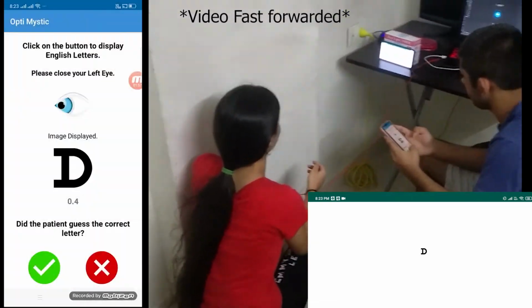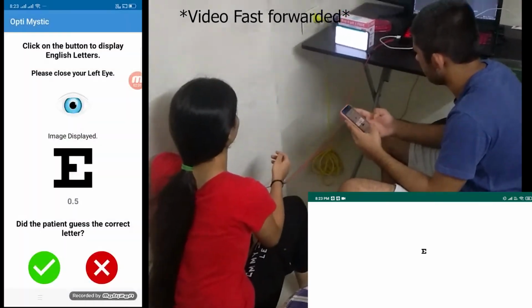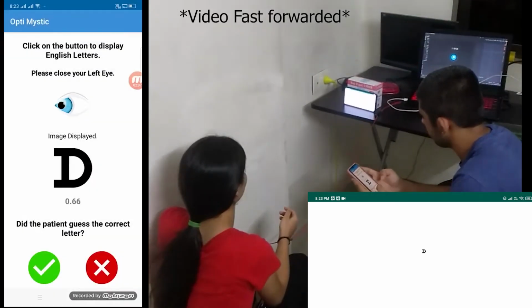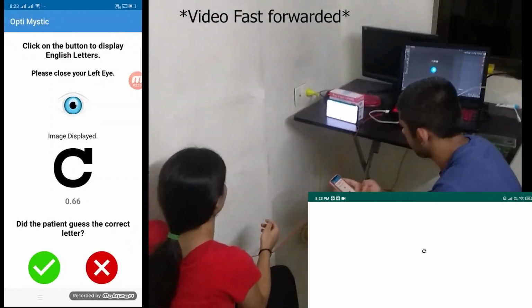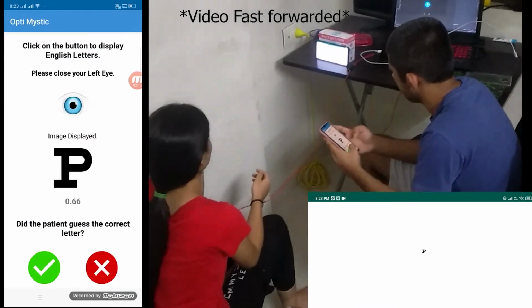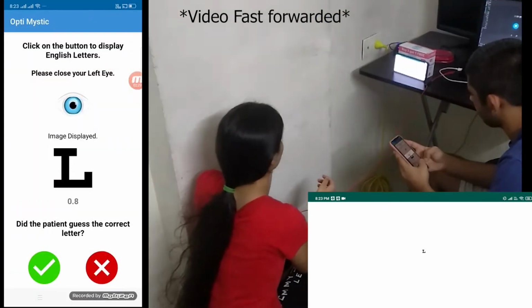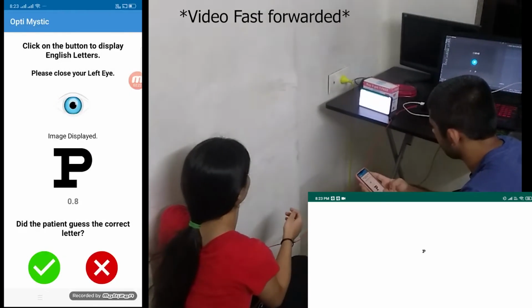We have used the concept of ray optics and computer graphics to create a digital chart which is not affected by distance and ambience. We have created a Flask API and a socket because of which the Android applications were able to communicate with each other. We have hosted the database on Atlas MongoDB which stores the data of the patient.